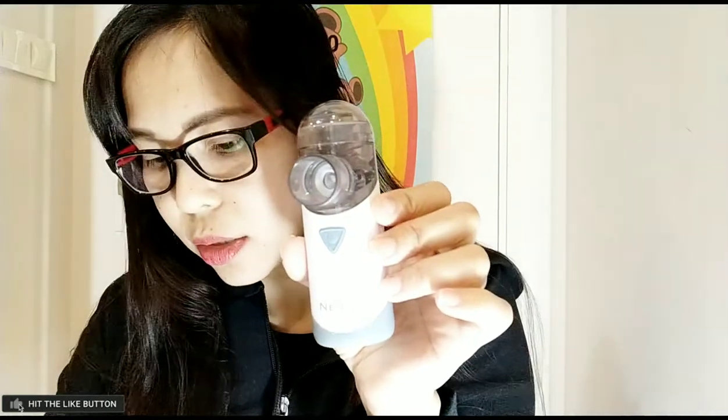So there is the mask here — this one is for my baby, the baby mask. And this one is for the adult, yes, this is the adult mask.